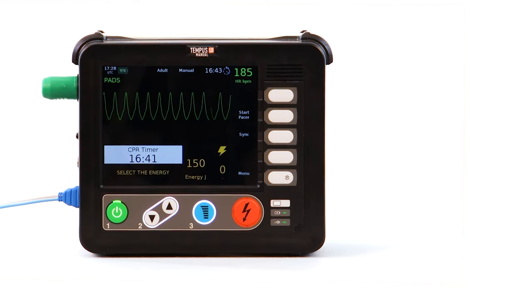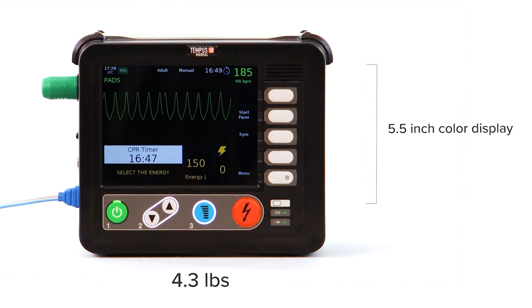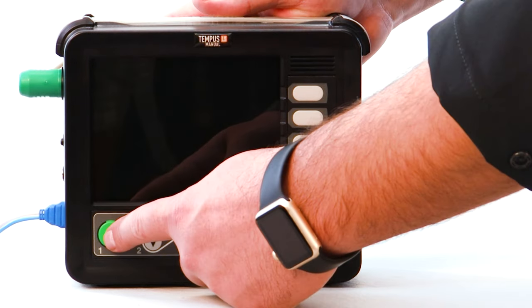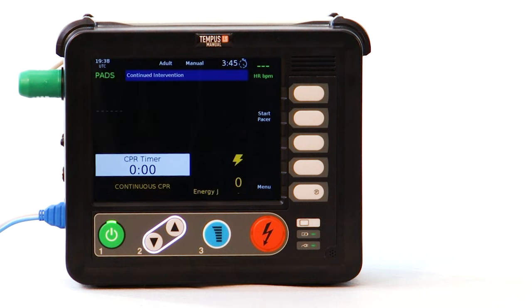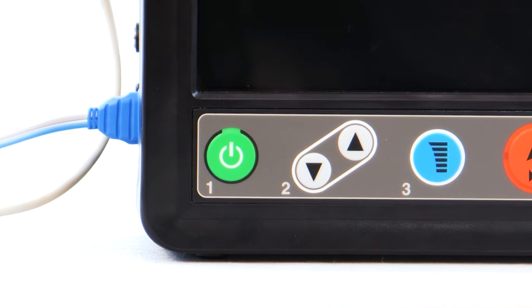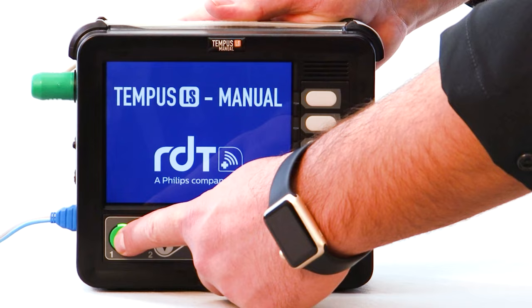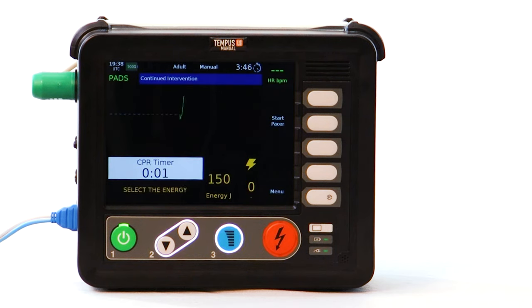The Tempus LS is fitted with a five and a half inch color display and weighs in at only 4.3 pounds. Utilizing Philips' trusted high-performance BTE biphasic waveform, the device has been designed to be easily deployed and deliver life-saving therapy within seconds of powering on. Clearly labeled membrane buttons with corresponding backlighting and audio alerts guide the user through treatment, helping to ensure timely delivery of therapy.